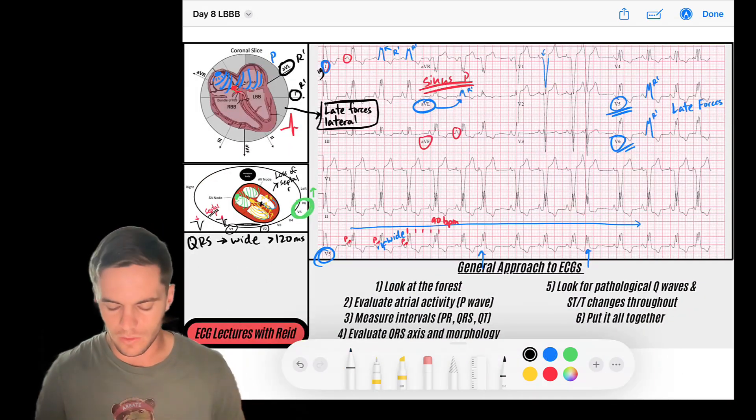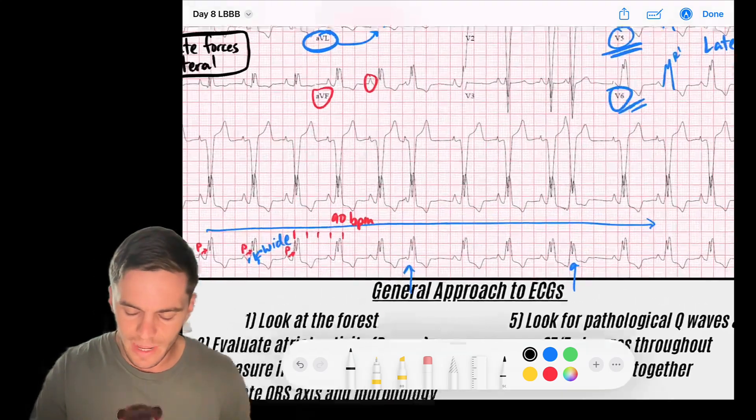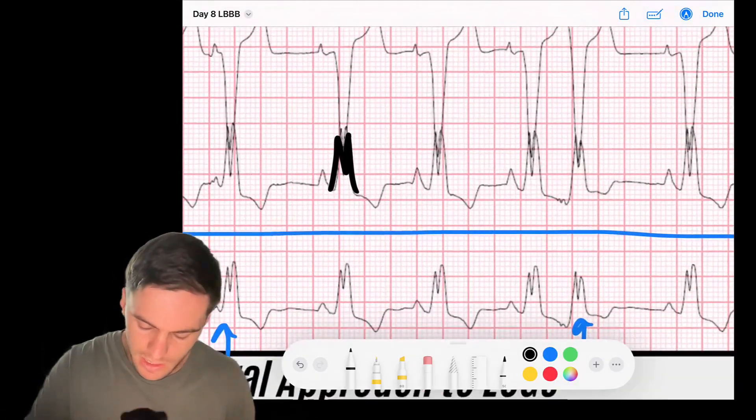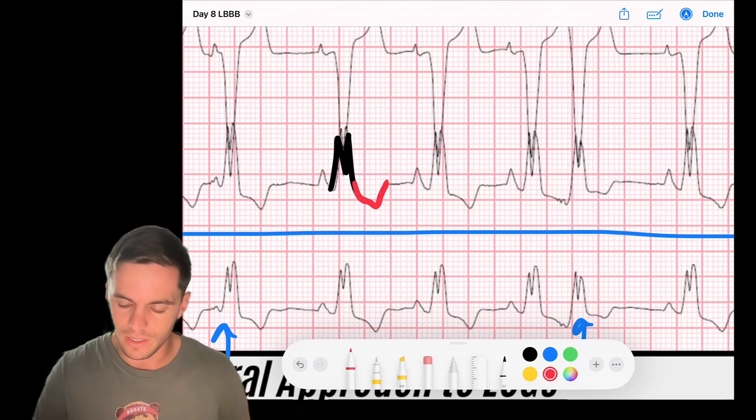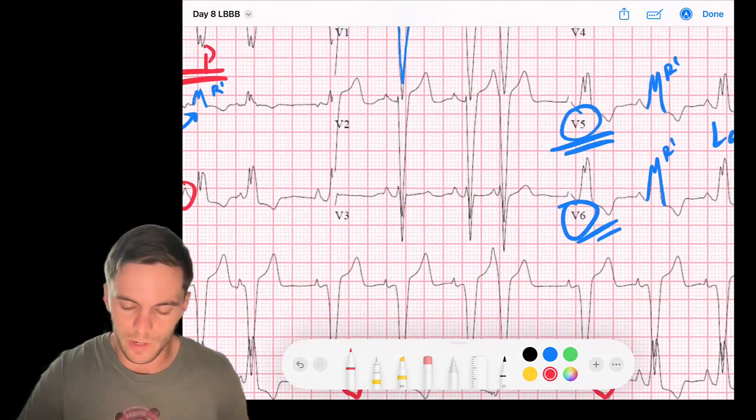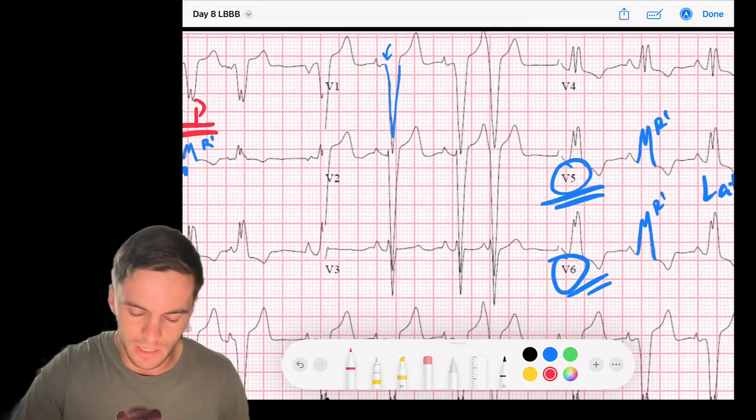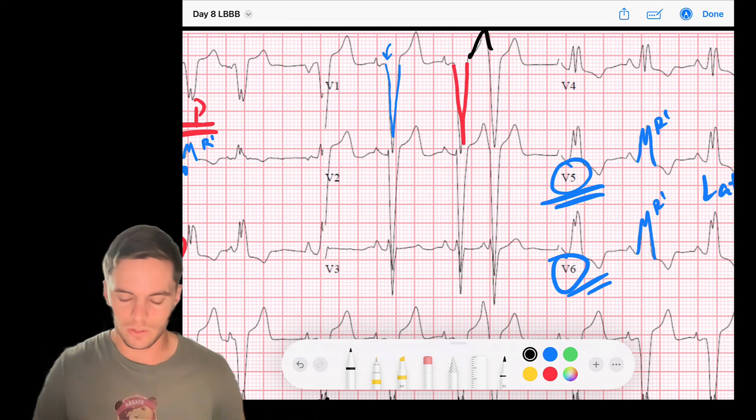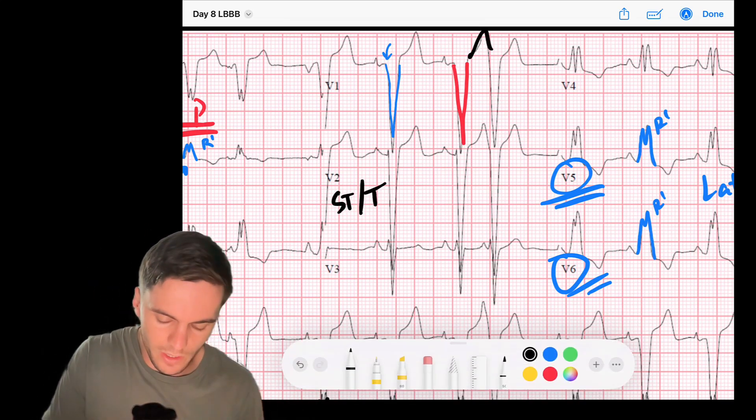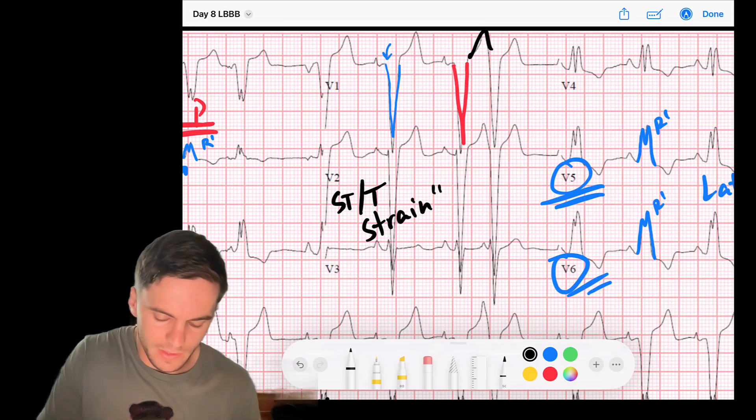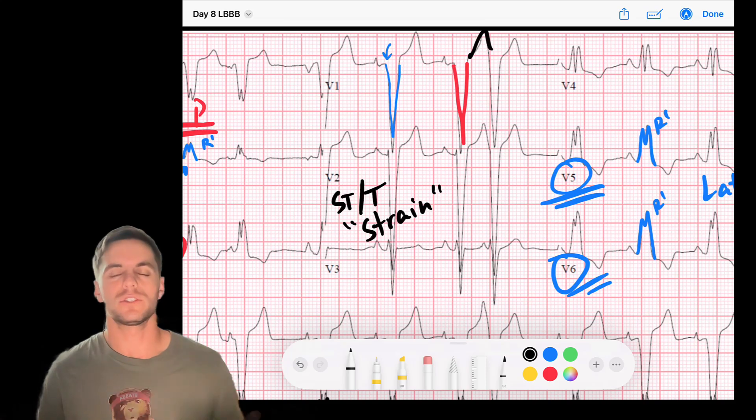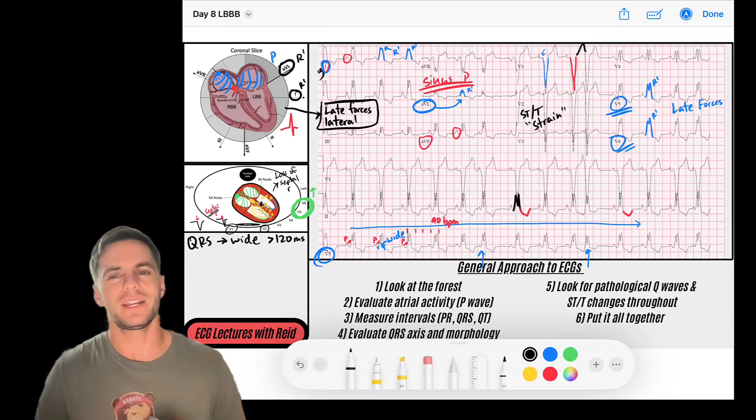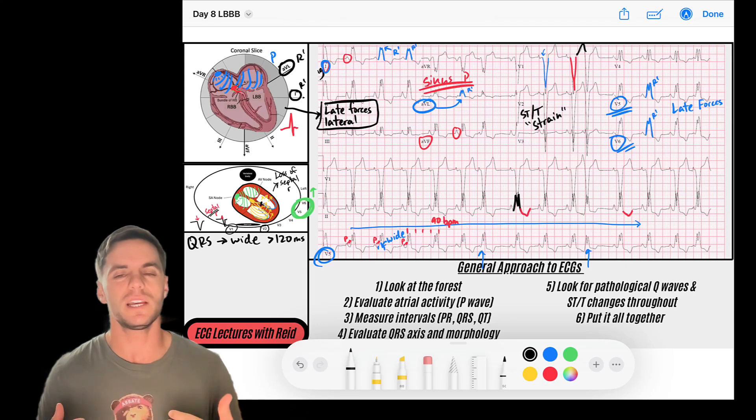And then there's one more thing I want to talk to you about generally with bundle branch blocks. It's that you see that after the QRS complex here, notice that the T wave and the ST segment are inverted. We have those inverted T waves. And it's kind of like that throughout the EKG. Anytime that there is a negative QRS, we have a positive T wave. Anytime that it's a positive QRS wave, a negative T wave. That's called ST slash T wave strain. And that strain pattern is because when we have aberrant conduction through the ventricles, you're also going to have aberrant repolarization. Remember that the T wave is representative of repolarization. So that's a little quick look for that ST and T wave strain. It makes it really hard to evaluate for ST and T wave changes on an EKG.